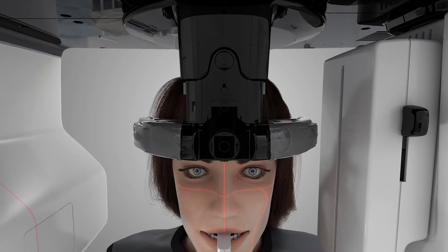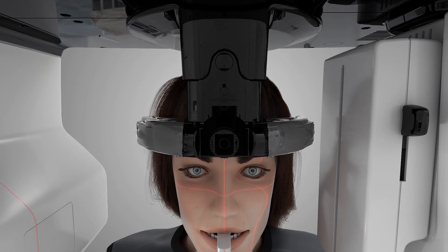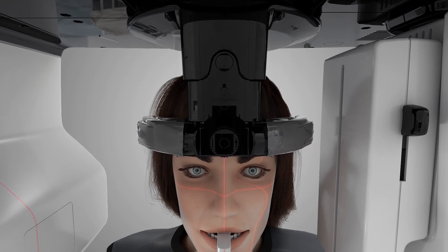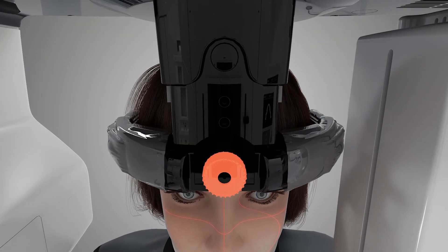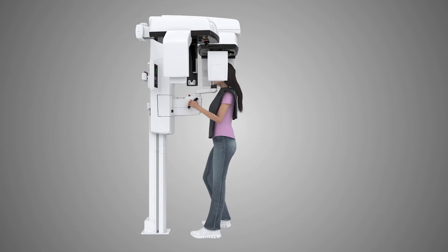Gently move the head support toward the patient by pressing both buttons and sliding the head support until it lightly touches the patient's forehead, then release the buttons. Turn the knob on the head support clockwise to gently close the temple support paddles. Ask the patient to take one step forward to straighten the spinal column. The patient is now slightly leaning backwards and should remain this way during the image capture process.